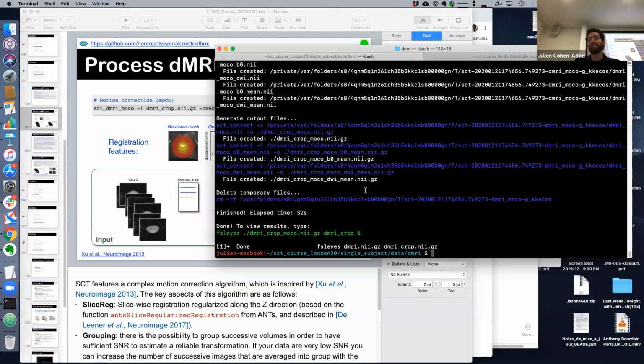But what would be the inherent accuracy if you say what's the area of a slice and it says 20 decimal points? Yeah. So the nerdy answer would be that the results are long float 64 quantization. So it's highly precise, and you probably don't need that precision.